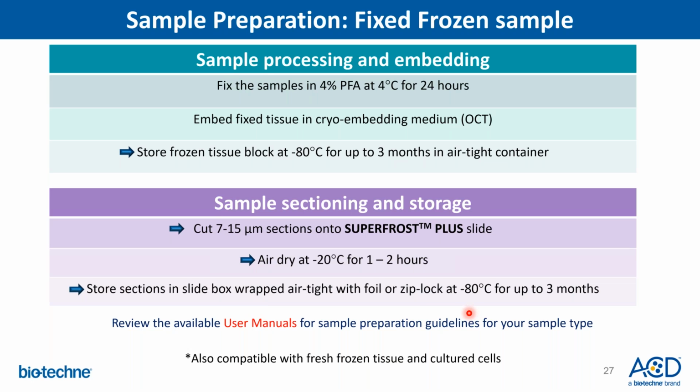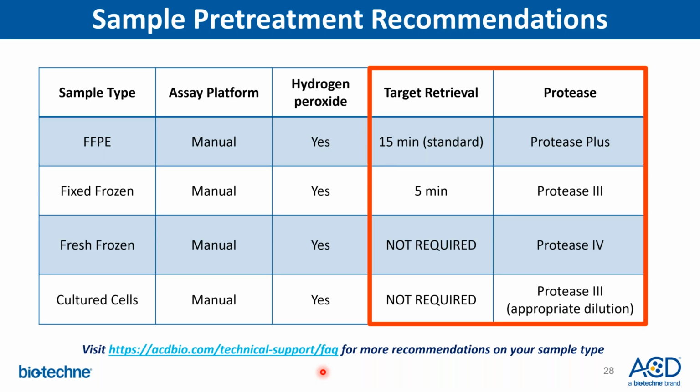I would like to point out that the workflow is also compatible with fresh frozen and cultured cells. I'm not showing the sample preparation guidelines for those in the interest of time, but it is compatible with those 2 sample types as well. Now, we'll look at some of the sample pretreatment recommendations.